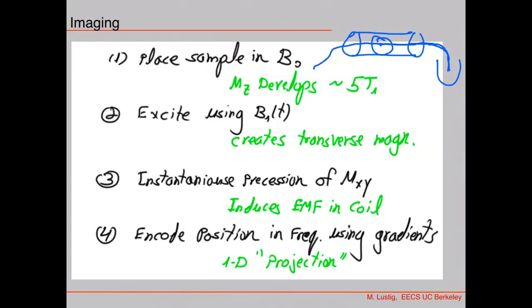So what people do is they take the pipe and roll it in a little bit inside so that the water spends enough time in the magnet such that it magnetizes, and that is fine. So it's something to be aware of, definitely, if you're doing flow experiments.